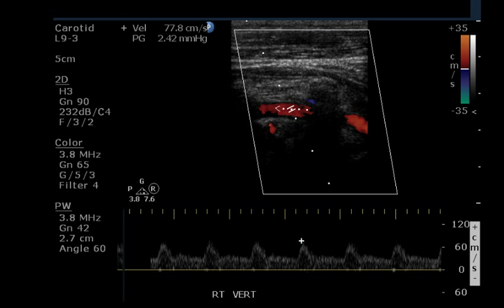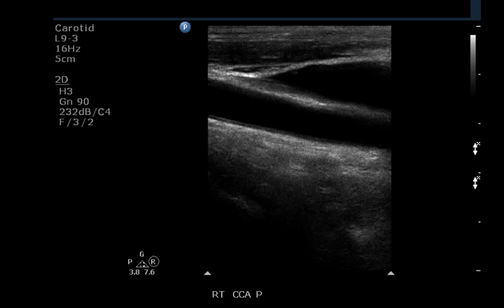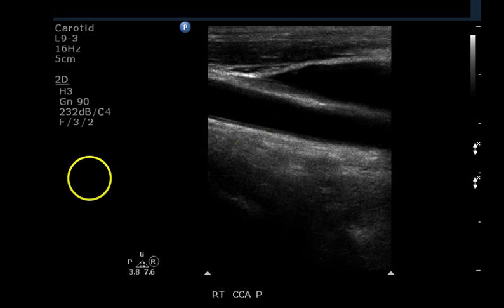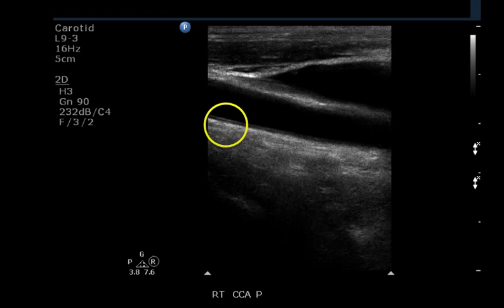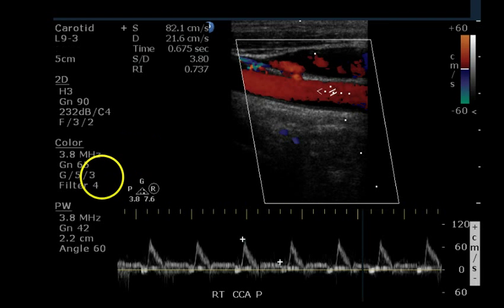The Doppler waveform for the vertebral artery is perfectly normal. This is an image of the common carotid artery in a proximal portion. Perhaps a trace of intimal thickening, although this is probably just good visualization of the intima and media together. Color Doppler with pulsed Doppler superimposed demonstrates normal flow velocities.